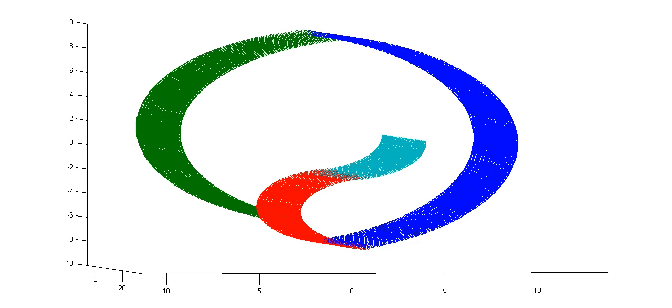In fact, neighboring voxels are slightly artificially correlated, sharing the same structure, because the voxels aren't cleanly isolated. The person moves a little bit, so you're vibrating between two neighboring voxels while you collect the data. So there's messiness, basically smearing or blurring of the data as it's collected.